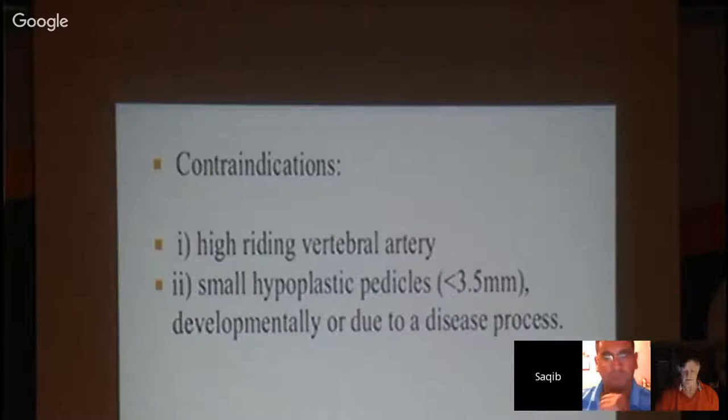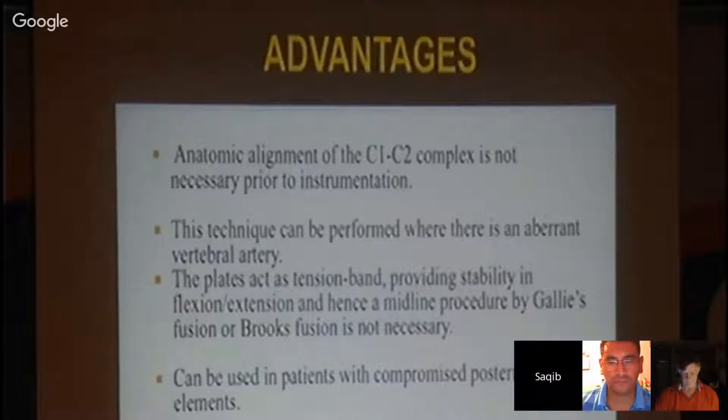Sometimes there's a very high riding vertebral artery, and yes, you need to look at that beforehand. You need to know, and there are some hypoplastic pedicles, and we see that quite commonly in Pakistan. It's important that when you're putting screws, you have to be careful and think about doing something else for these patients. Obviously, there are advantages of this C1-C2 complex.